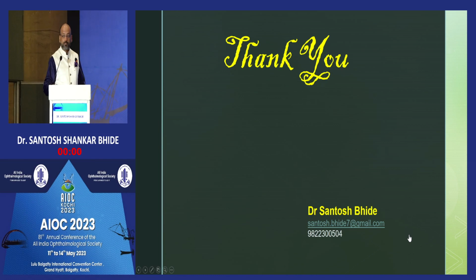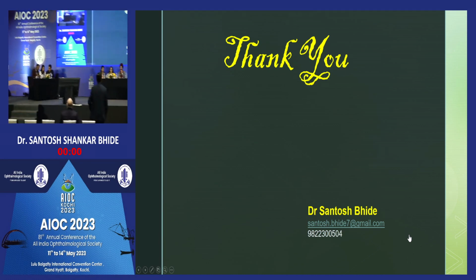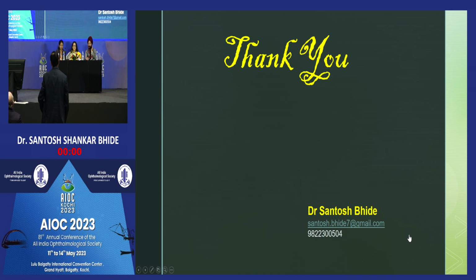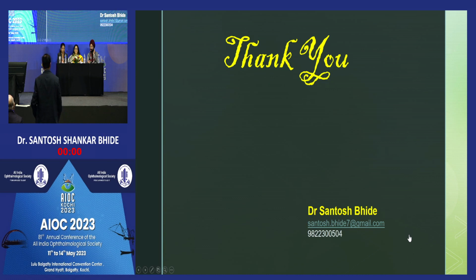Dr. Santosh sir, do you recommend OCT evaluation as a routine in all your cataract surgery cases? OCT evaluation and dry eye evaluation? Exactly. I think with the premium, it's a must.